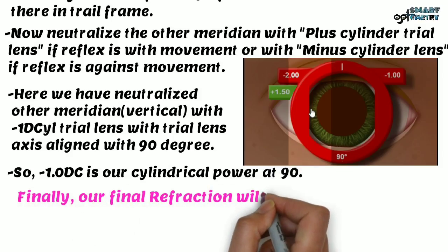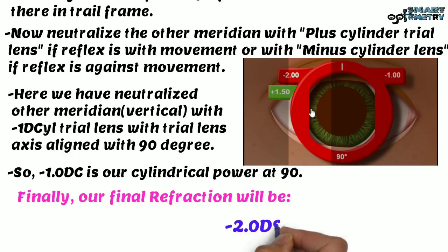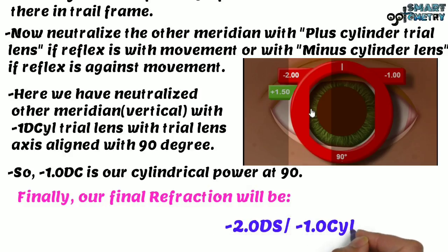Finally, our final refraction is minus 2 diopter spherical and minus 1 diopter cylindrical at 90 degree axis.